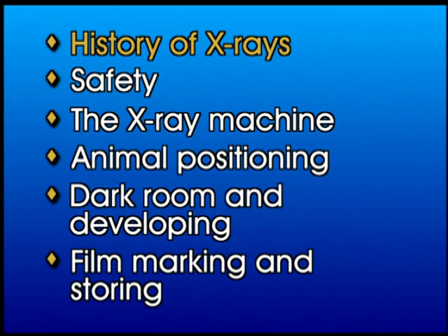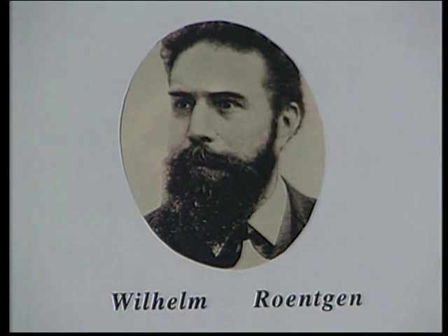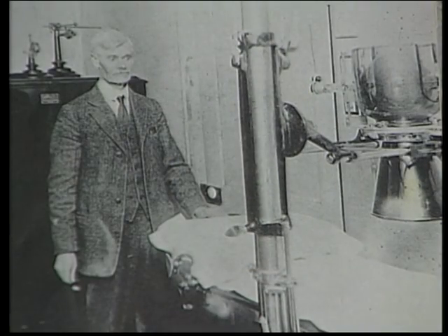radiographs. The mystery of the X-ray was not discovered until 1895. A physicist by the name of Röntgen discovered that by passing electricity through a cathode tube, a mysterious form of light energy was emitted that would pass through certain materials like wood and flesh. This same mysterious energy would not penetrate other materials such as metal and bone. He could pass these newly discovered rays through objects and capture them on photographic film. Röntgen's discovery of X-rays opened the door to modern-day veterinary radiology.